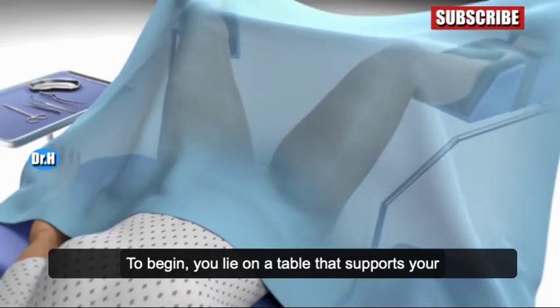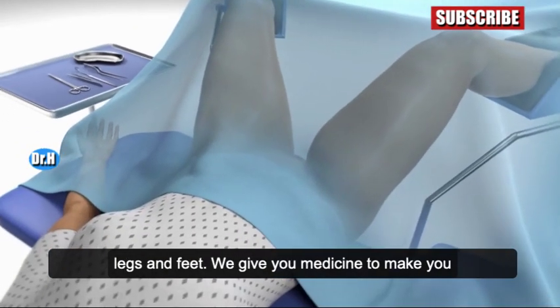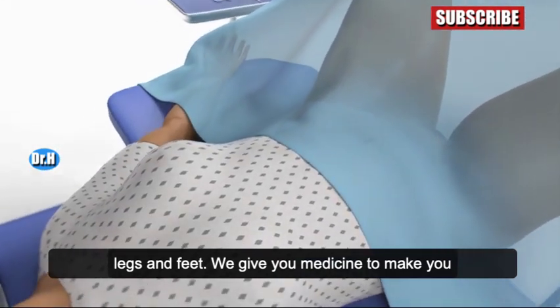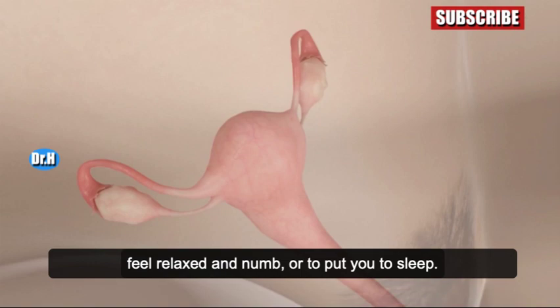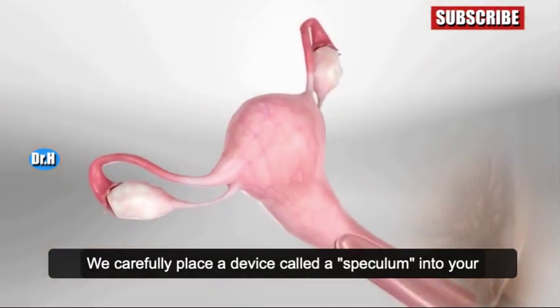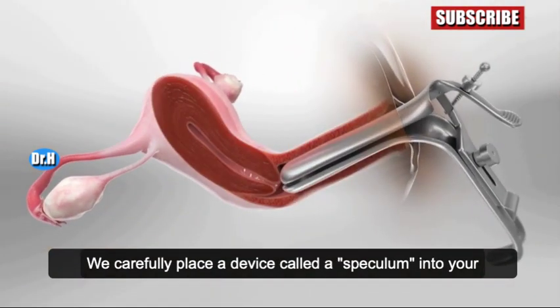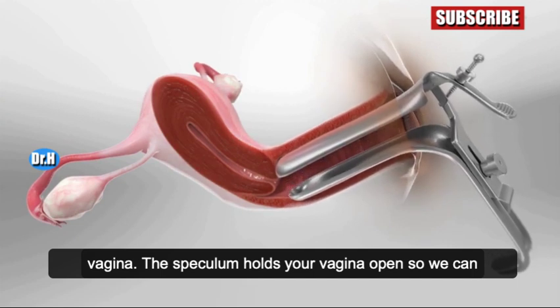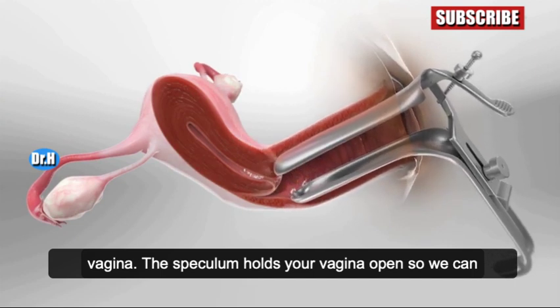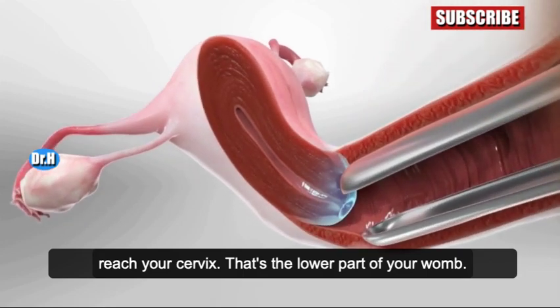To begin, you lie on a table that supports your legs and feet. We give you medicine to make you feel relaxed and numb, or to put you to sleep. We carefully place a device called the speculum into your vagina. The speculum holds your vagina open so we can reach your cervix — that's the lower part of your womb.